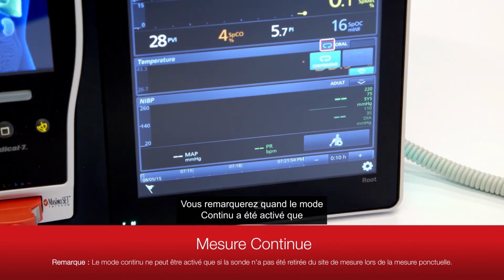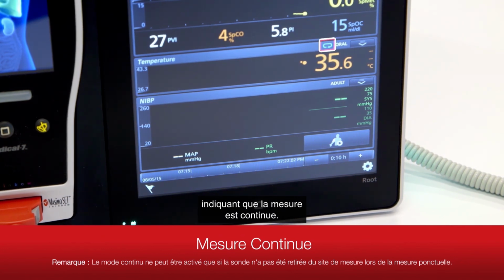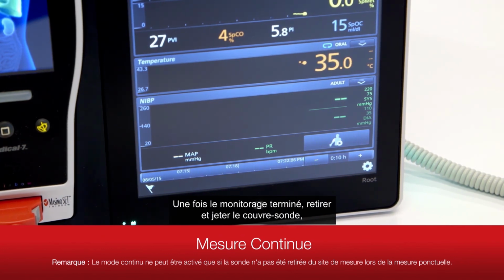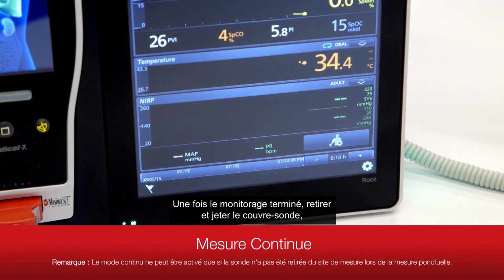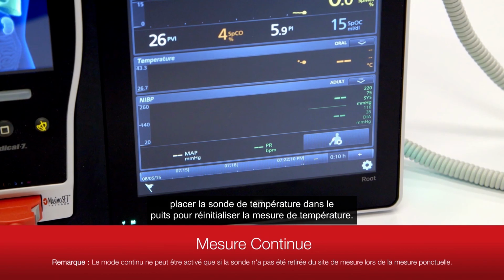You will notice when continuous mode has been activated, the blue continuous symbol appears at the top of the temperature window, indicating the measurement is continuous. When finished monitoring, eject and dispose of the probe cover. Dock the temperature probe in the probe well to reset temperature measurement.